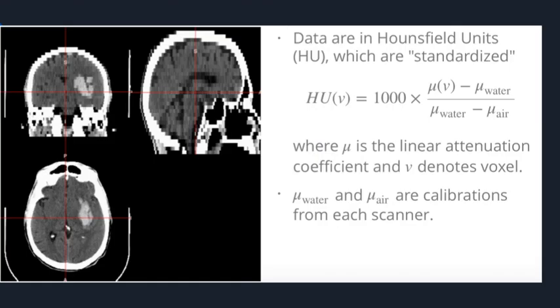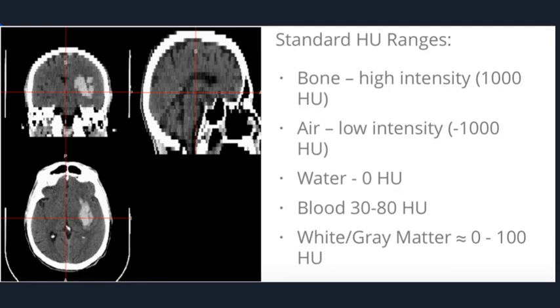This density from a CT is commonly measured in Hounsfield units, or HU, named after Sir Godfrey Hounsfield. They are relatively standardized, where if you were scanned in two different scanners, they'd be close in absolute value of the units. The values are standardized to the density of air and water. Values of water are around 0, and values of air are around -1000 or sometimes -1024. The brain and tissue fall within 0 to 100 HU in CT where contrast agents haven't been delivered.